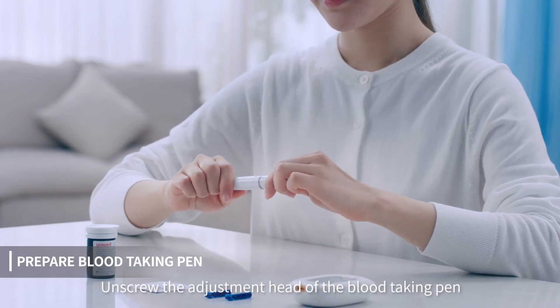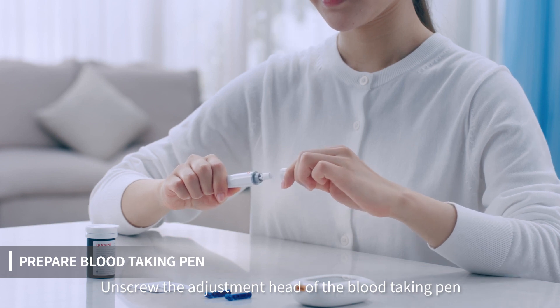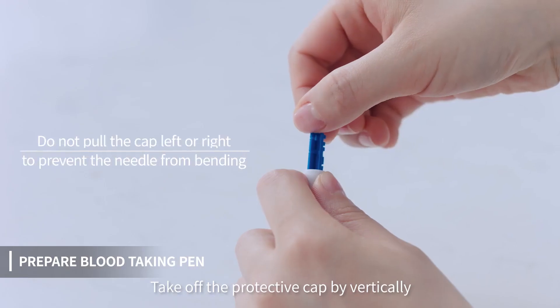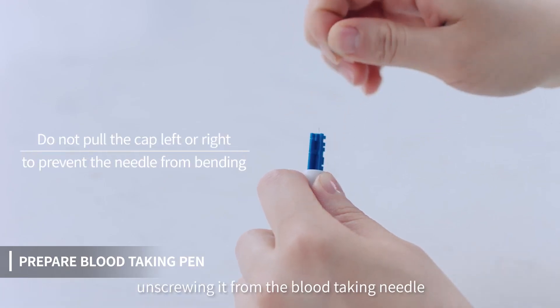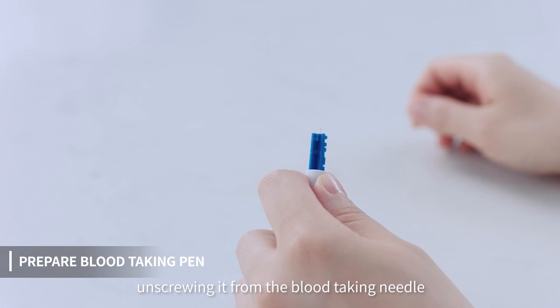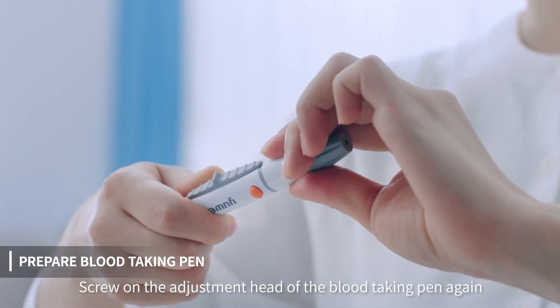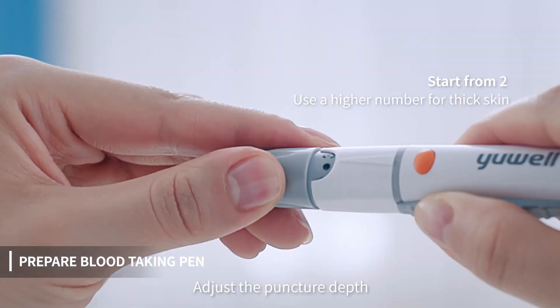Unscrew the adjustment head of the blood-taking pen. Install the blood-taking needle into the needle holder. Take off the protective cap by vertically unscrewing it from the blood-taking needle. Screw on the adjustment head of the blood-taking pen again, and adjust the puncture depth.